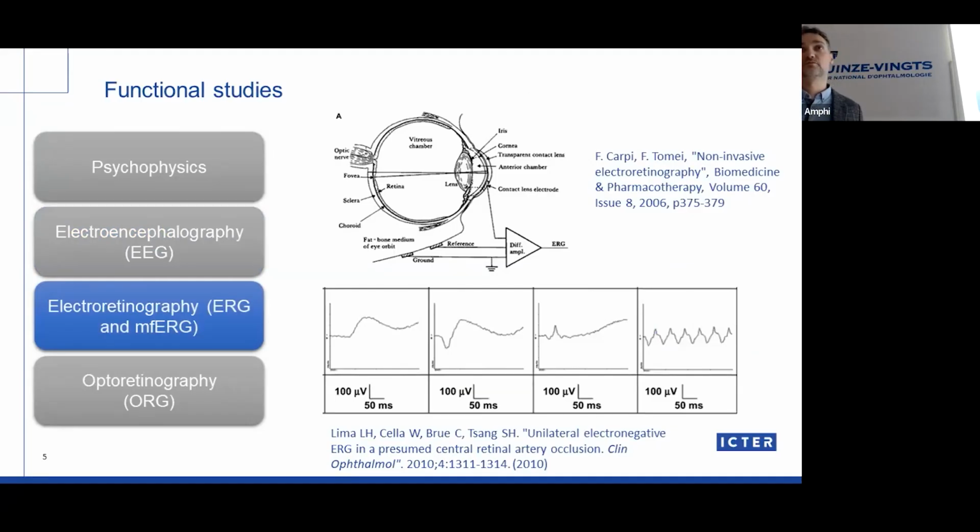And then there is electroretinography, which has been developed for many years. In this method, electrodes are mounted usually on the cornea and in proximity to the eyeball. In this approach, the changes in electric current or potential are being measured. These experiments have been done in flicker mode, in light-adapted conditions, or in dark-adapted conditions with a single pulse stimulation.